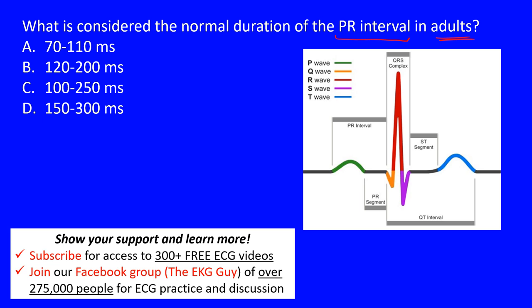Let's go over the cardiac cycle. This is a normal cardiac cycle. Here in green is our P wave. The Q wave is that first negative deflection shown in orange. The R wave is noted here in red. The S wave is the negative deflection after the R wave — a positive deflection — shown here as well.